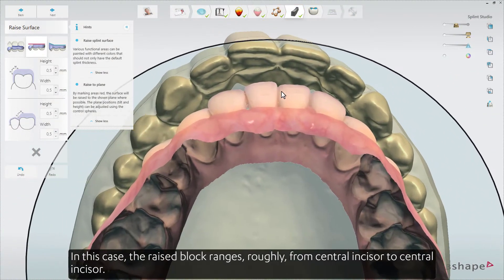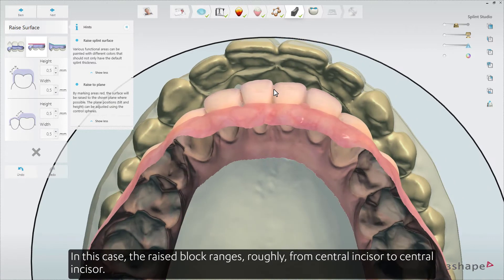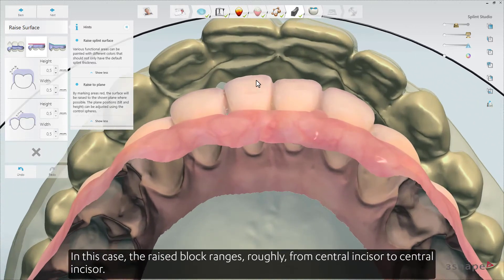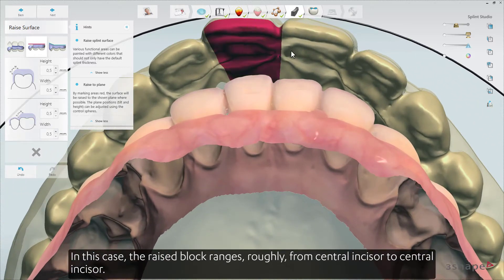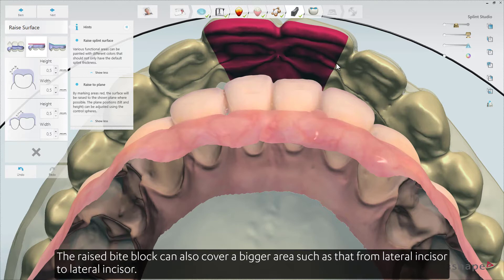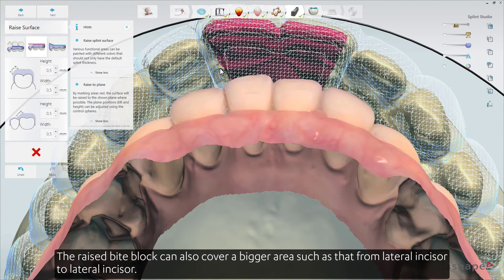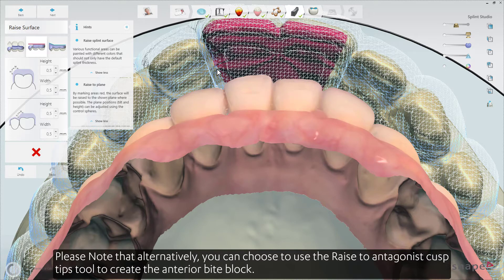In this case, the raised block ranges roughly from central incisor to central incisor. The raised bite block can also cover a bigger area, such as that from lateral incisor to lateral incisor.